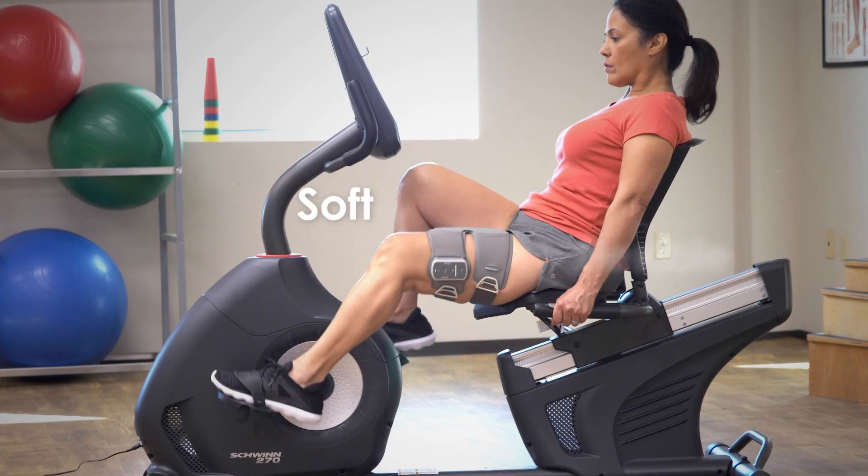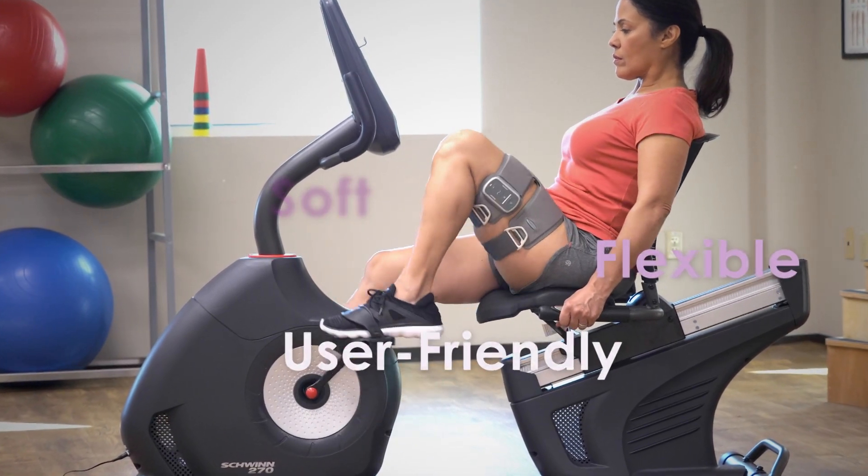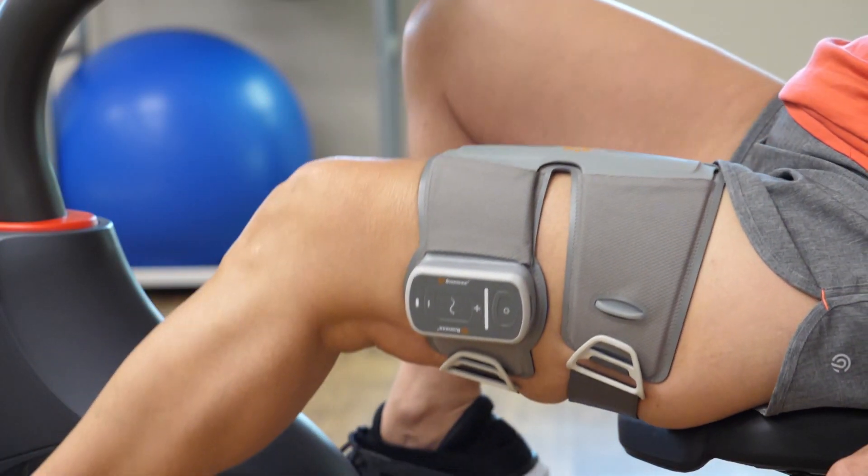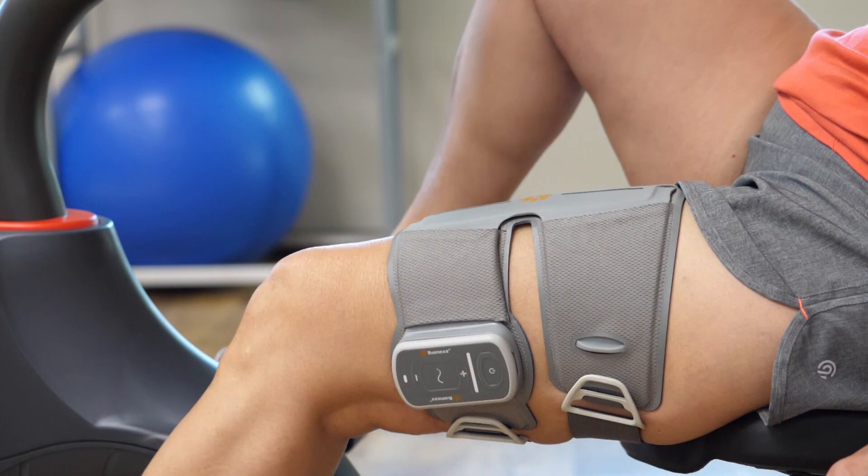The soft, flexible, and user-friendly cuff uses a proprietary learning algorithm that adapts to kinematic changes in real time, deploying stimulation precisely when needed.